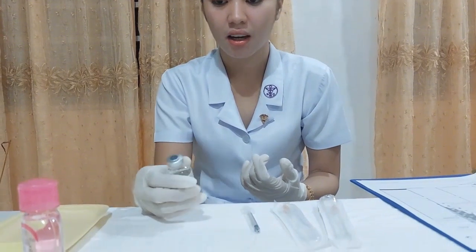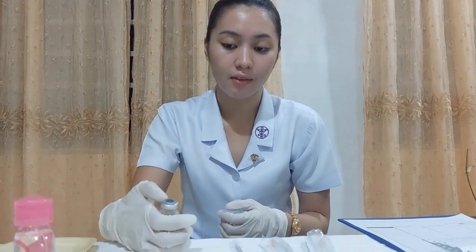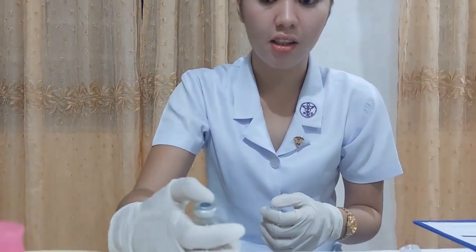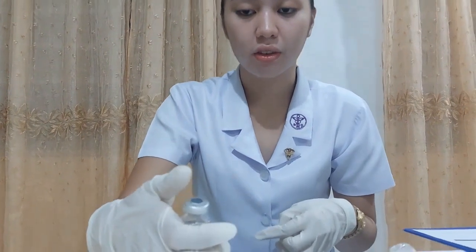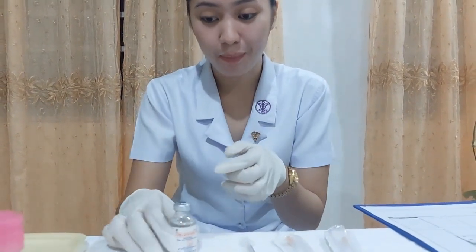I'm going to remove the protective cap if present. As you can see, this vial doesn't have a protective cap on it, so I'm just going to still demonstrate it. In removing the protective cap, we're going to just flick it off like this. Imagine if there's a protective cap there, we're going to flick it off. Now that the protective cap is removed, the rubber stopper is exposed.